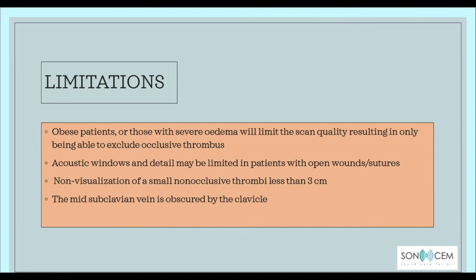Okay, so we are coming towards the end of the lecture. We need to know that there are a few limitations in doing ultrasound for DVT, especially in obese patients or those with severe edema. These conditions will limit the scan quality, resulting in only being able to exclude occlusive thrombi. And it can be limited in patients with open wounds or sutures.